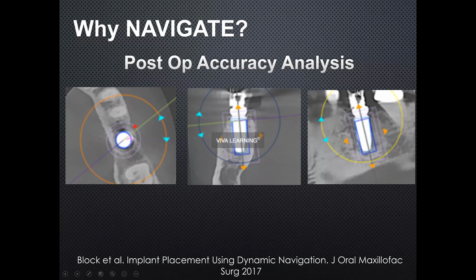And that's normal to have just a little bit of variation, because in this case, when the implant's placed, this cortical lingual bone's going to kick it off a little bit. And then you notice every time you look at your slow speed handpiece, there's going to be a little wobble with the attachment when you click in your osteotomy burr or your slow round when you're doing restorative. So that would give you that type of deviation. But going back to the Block study, it's about 11% more accurate in these studies when you're utilizing guidance versus freehand.